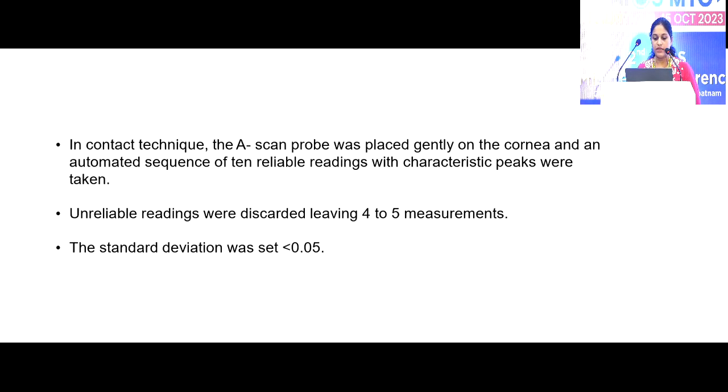In contact technique, the A-scan probe was placed gently on the cornea and an automated sequence of 10 reliable readings with characteristic peak were taken. The standard deviation was set less than 0.05.